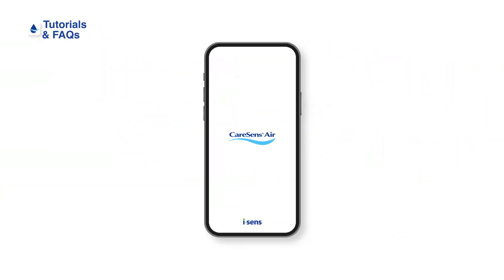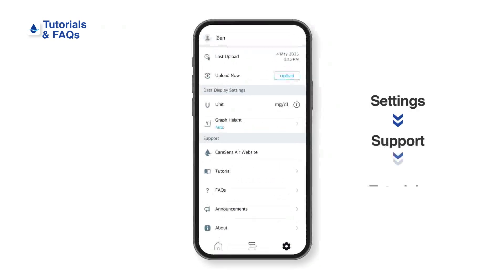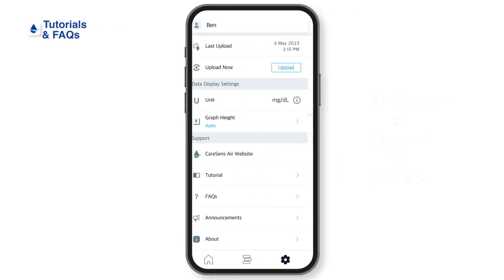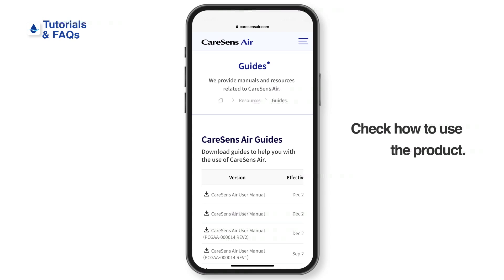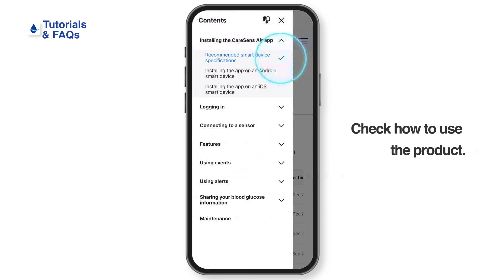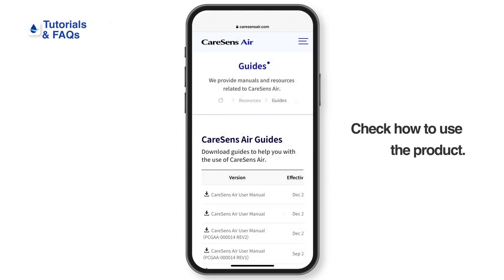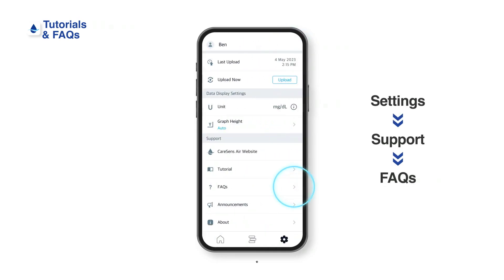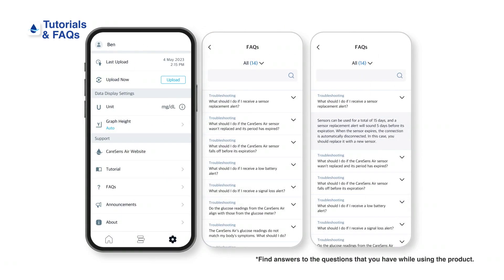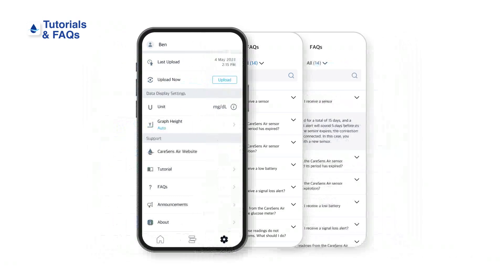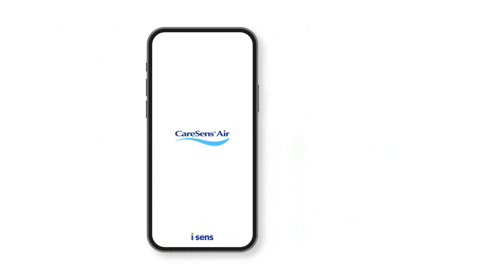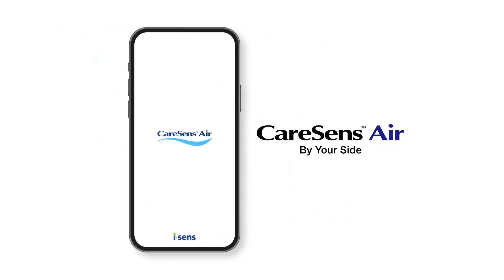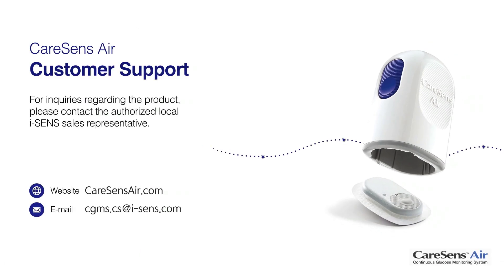The Kerasens Air app provides tutorials and frequently asked questions. Tap Tutorials under Support and Settings to check the product guide. Tap Frequently Asked Questions from the settings menu for more information. Please contact the authorized local iSense sales representative for inquiries about the product.